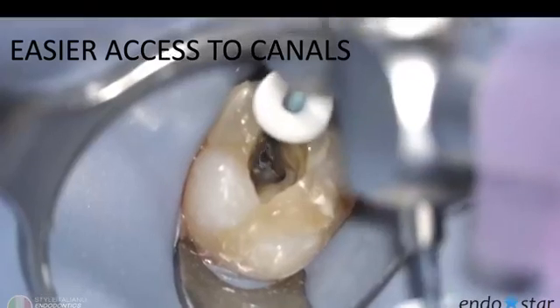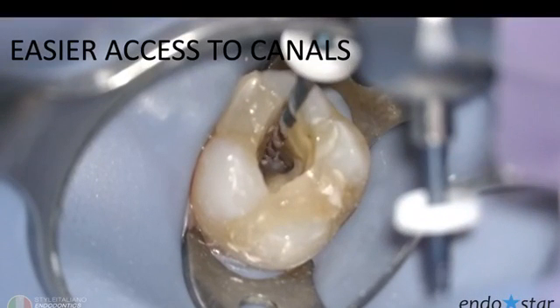We can go inside without a problem. The access is very important. Sometimes we are working on mesial canals and we don't want to open too much the access cavity. So we keep it as small as possible and we pre-bend the instrument to go inside the canal to have the access to this canal.